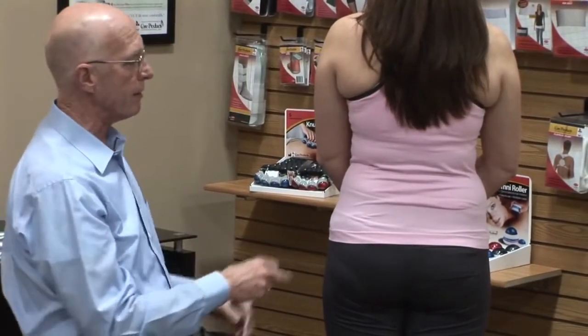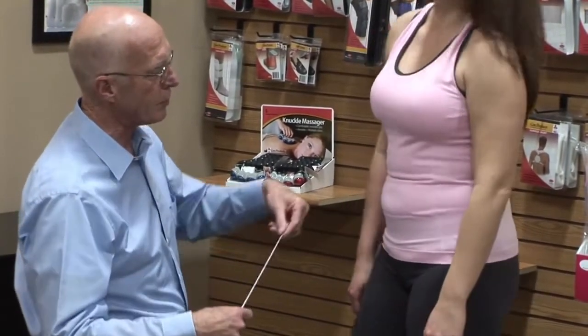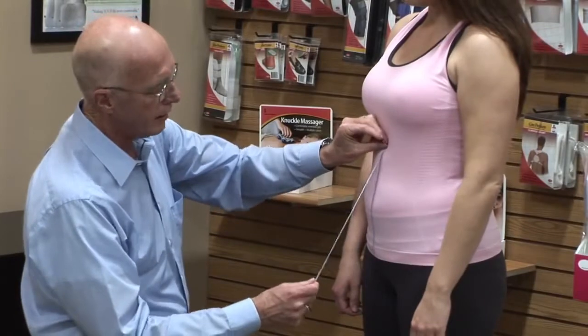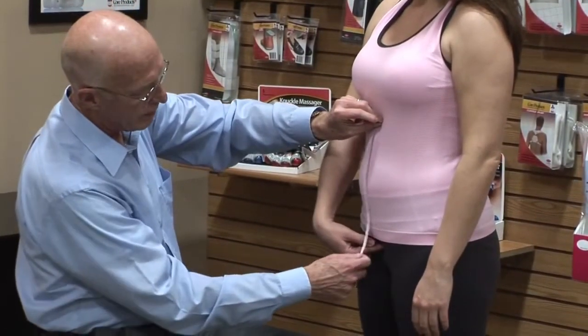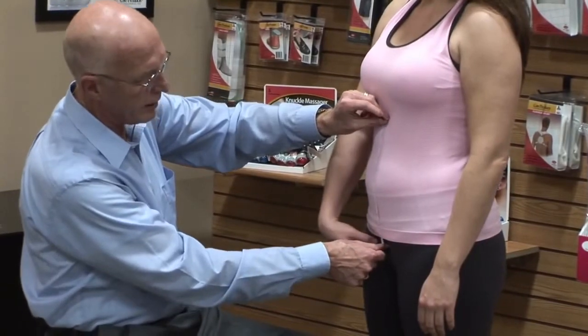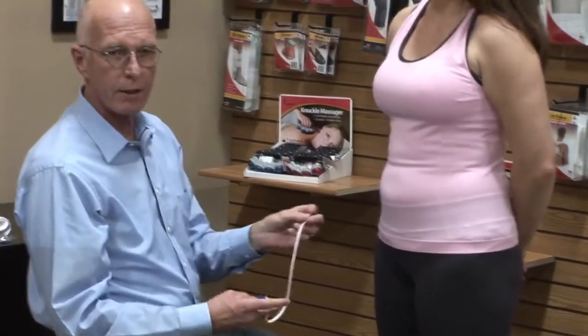We also want an anterior length measurement. We go from the top of the rib cage at the xiphoid process down to the symphysis pubis — the bone below the belly button. That gives us the anterior length measurement. Document all of those, but again, you're going to size the product to the hip measurement.